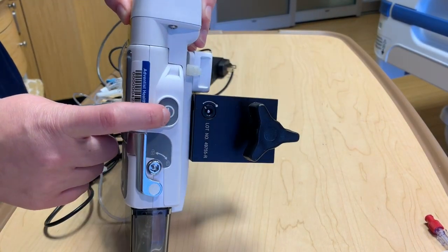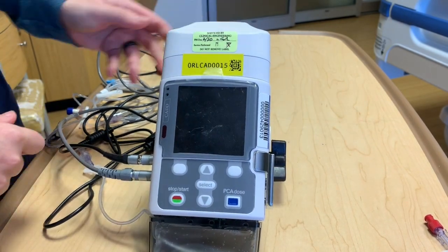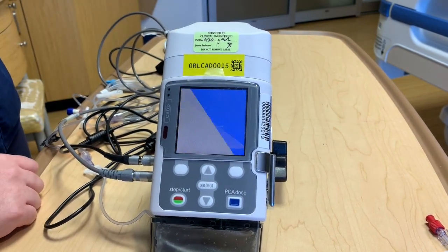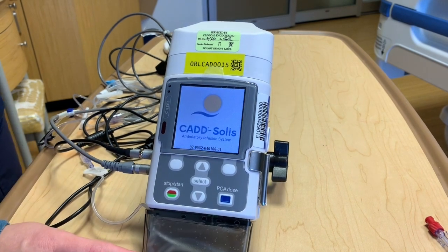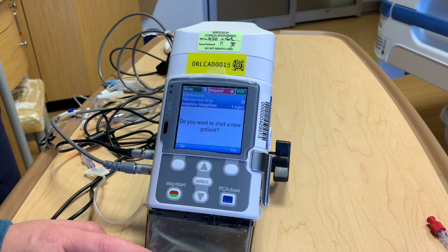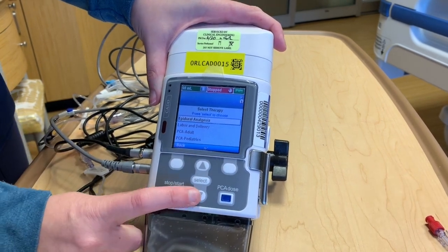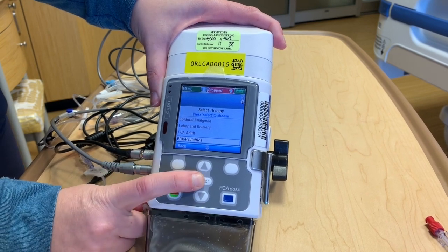To turn on the pump, the on/off button is over here and it's going to take a few moments. It's going to ask us if we want to start a new patient, so we'll say yes, and then you would pick your library, which would be PCA Pediatrics.